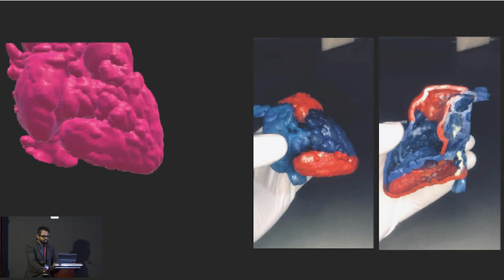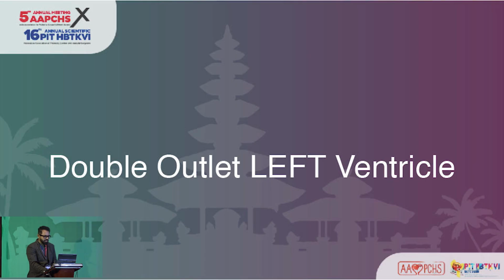A DORV with crisscross ventricles. Here again, we found that this LV was routable into this pulmonary artery, which was right above the VSD, and we planned this surgery down to precision, and this surgery could be executed successfully. These are really complex operations otherwise.